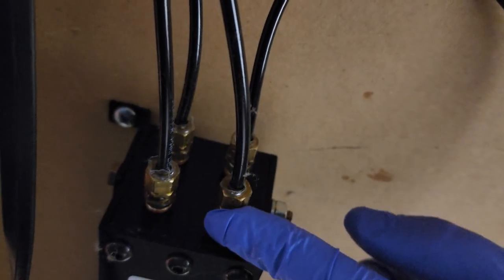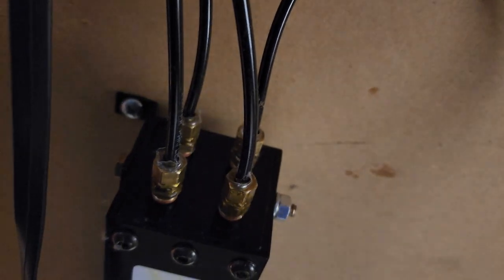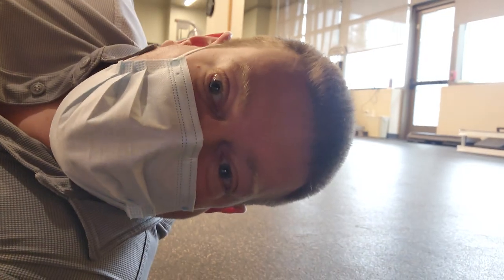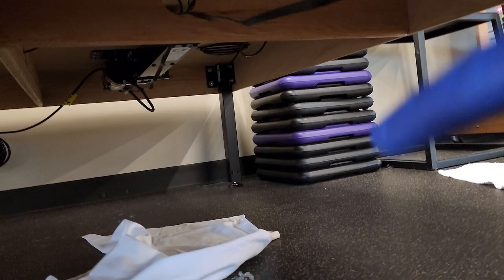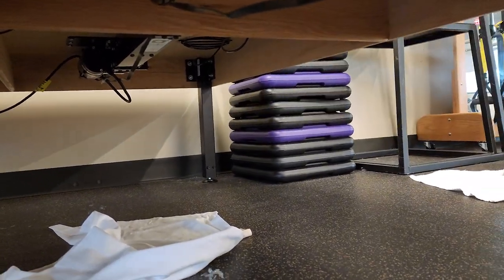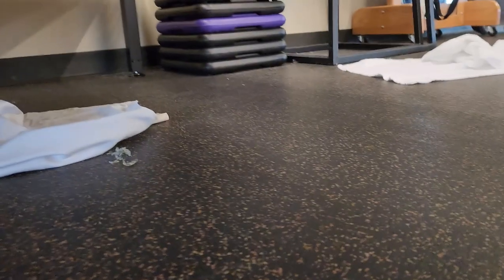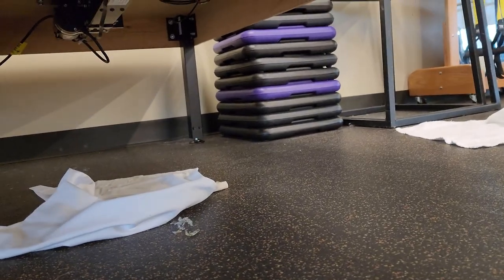And now we're ready. We're going to switch these two around. This one and this one. Flip them around, and then we're going to test it out and see if it changes the symptoms. Hopefully it does. Okay, the lines have been switched. So let's go ahead and see the results. So that was the problem child. It was not going up and down. And I switched it with this one right here. So let's see what goes on.